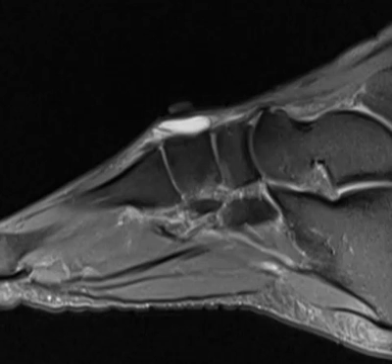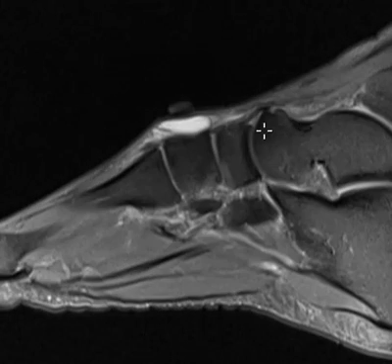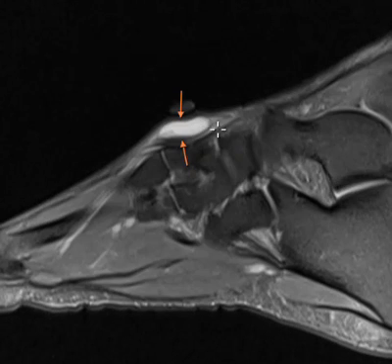Hello, this is Dr. Gay from FirstLake MRI and this is an example of a ganglion cyst in the foot. Ganglion cysts are just benign fluid collections. They're usually in the foot or ankle or the wrist, and this is a good example of just a simple little ganglion cyst in the dorsal foot.